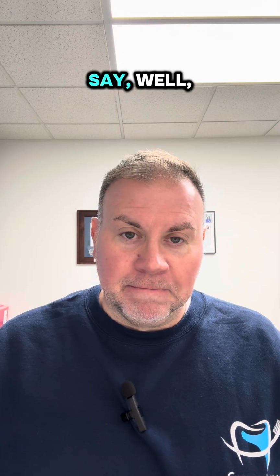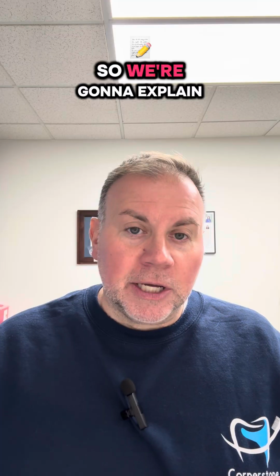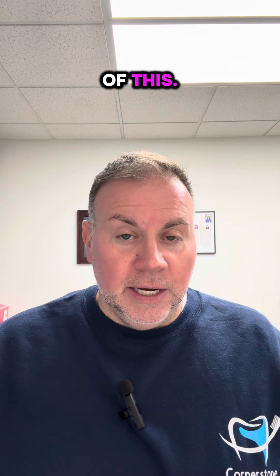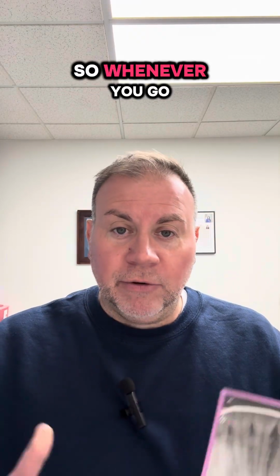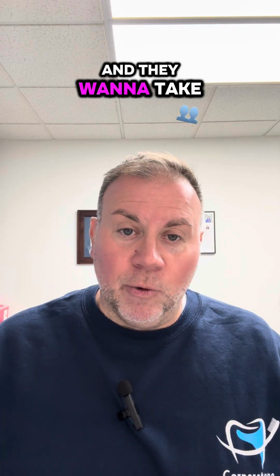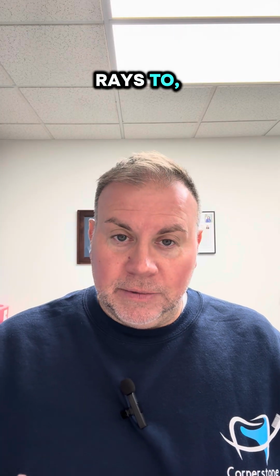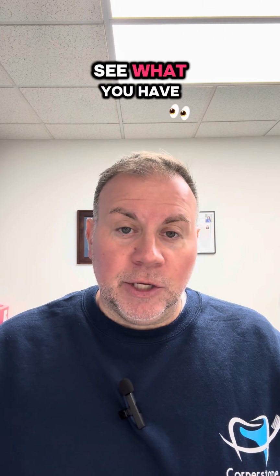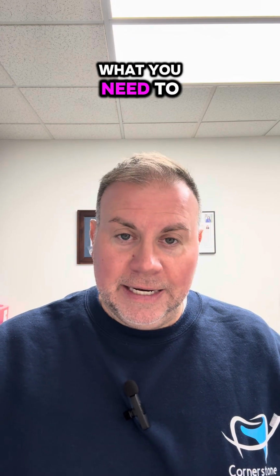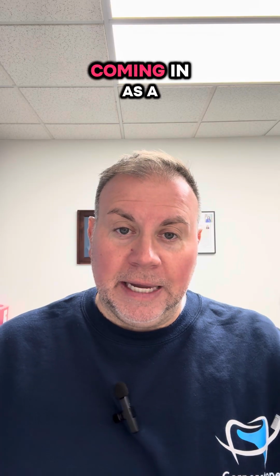You hear patients say, "Well, I had X-rays taken 2, 3 years ago," or "You took X-rays last time." So we're going to explain the difference in the X-rays and why it's so important to stay on top of those. So first thing we're going to talk about is a dental X-ray. Whenever you go to a dental office and they want to take X-rays, typically as a new patient, it's your first time coming in. They want to see what's going on, establish you as a patient, see what you have had done, and see what you need to have done.